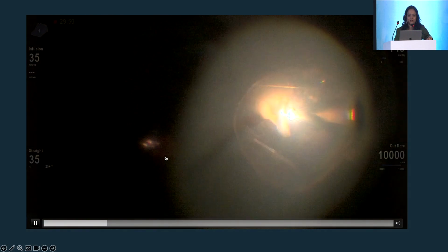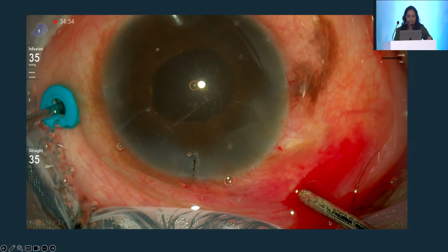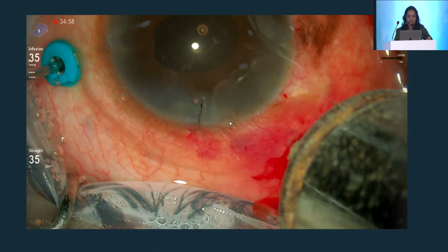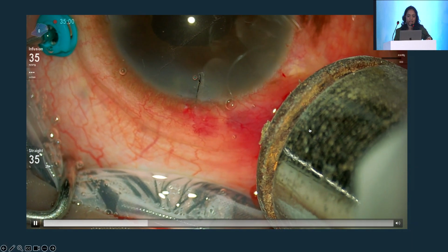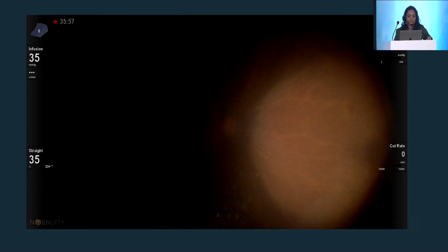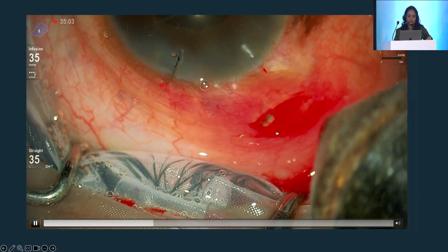Here there is a GRT, and after base shaving and freeing all the GRT edges from adherent vitreous, the foreign body was now tackled. This has probably become demagnetized after a long time in the eye, and I tried using a handheld magnet and removing it till the sclerotomy site, but the external magnet could not manage to remove it.